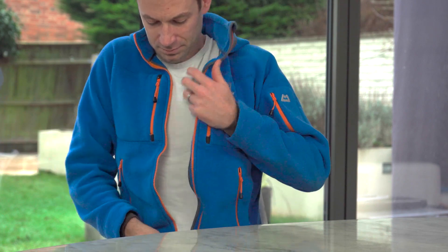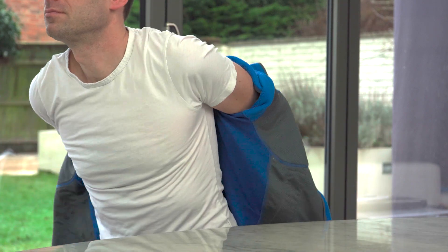First, remove any loose or bulky items of clothing from your arm. For the best accuracy, perform the test on a bare arm or over thin clothing, like a t-shirt. The test should normally be performed on your left arm.